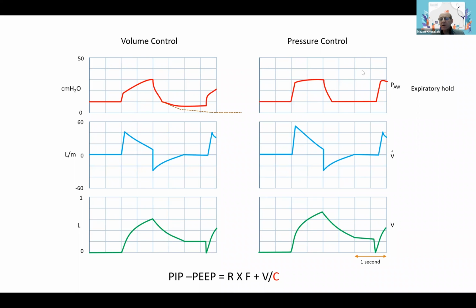On the other hand, here the pressure is determining how much volume you're going to get in. If that pressure is providing you with adequate volume despite the leak, let's just say that you cannot correct the leak. Okay, in both cases, it doesn't matter. If you correct the leak, we're done. We solve the problem. The situations that are difficult are the situations where I cannot remove that leak.